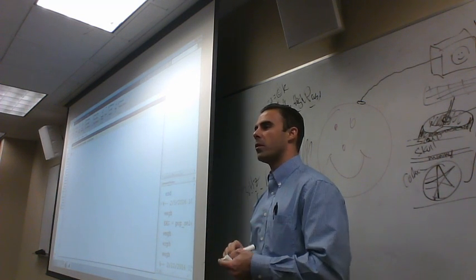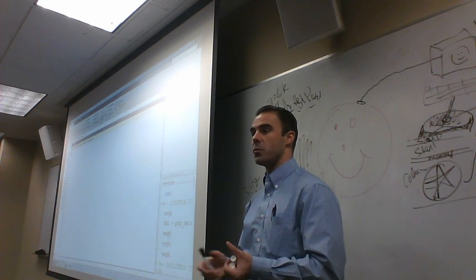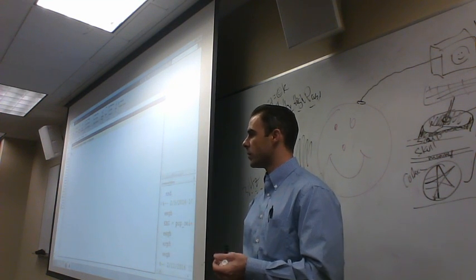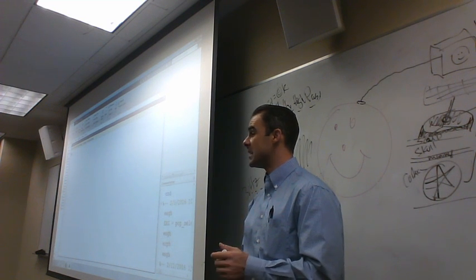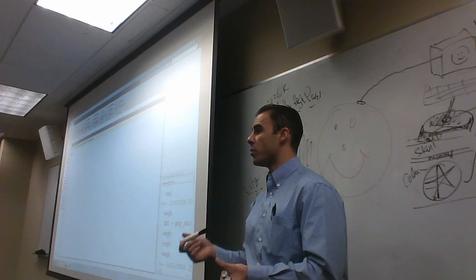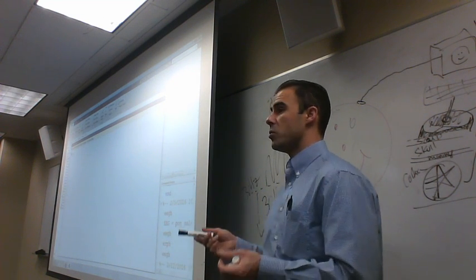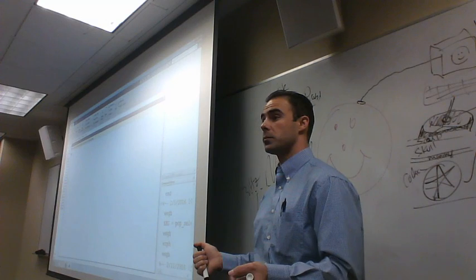Now here's the thing I wanted to mention. It's an important part about filtering, and Steve Luck's book that we have assigned dives into this in a lot of really good detail. But the important point to keep in mind is that when you're filtering data, you're distorting it. One way or another, you're adulterating the data.